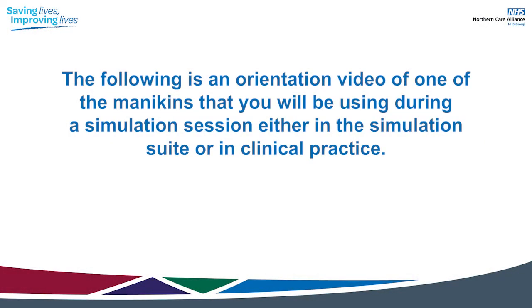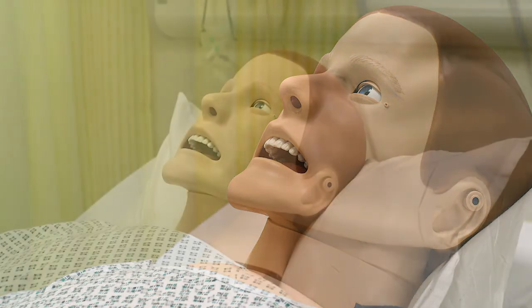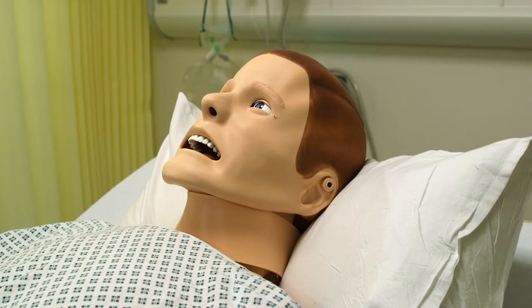The following is an orientation video of one of the mannequins that will be used during a simulation session, either within the simulation suite or in clinical practice. The simulation mannequin provides an opportunity for clinical staff to practice their healthcare skills in a safe learning environment. The mannequin itself is fundamentally a computer in a rubber body that can do a range of realistic actions. The mannequin is controlled to allow changes to its presentations and observations in line with the scenario learning objectives that have been written to support your clinical area and your level of learning.